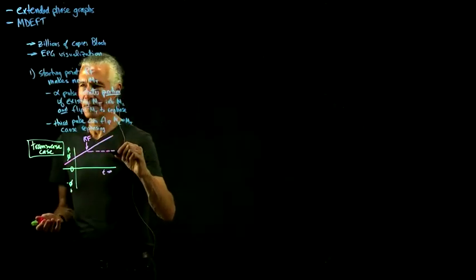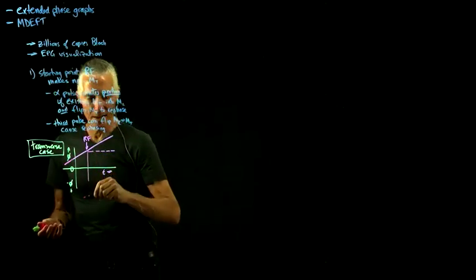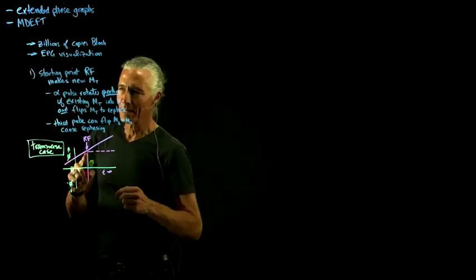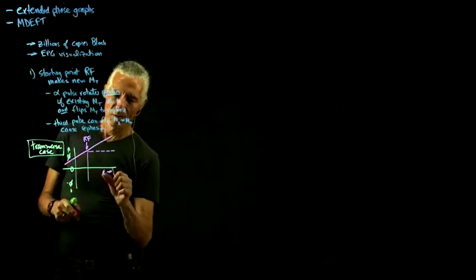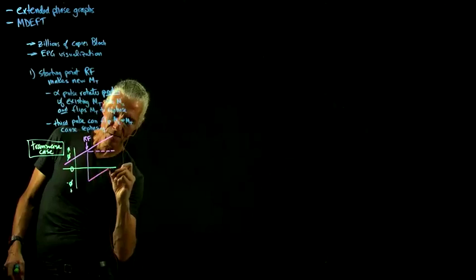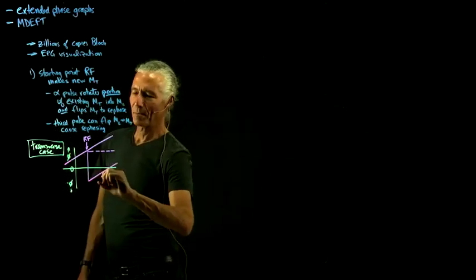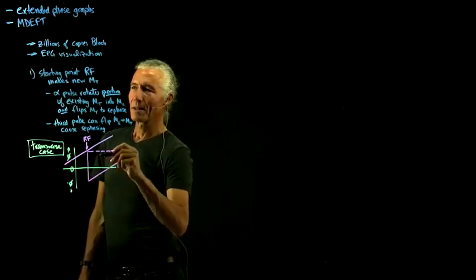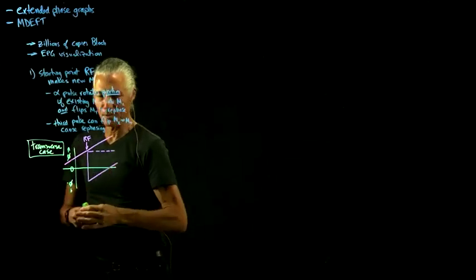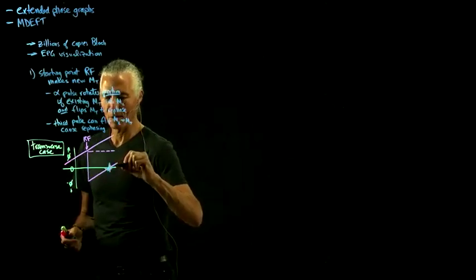That's the saved magnetization. And then we also flip some of the transverse magnetization so that it will begin to rephase. So this is our diagrammatic picture of how we made the ones that were ahead behind. After the same amount of time, this is where the echo appears, right here when you cross 0.